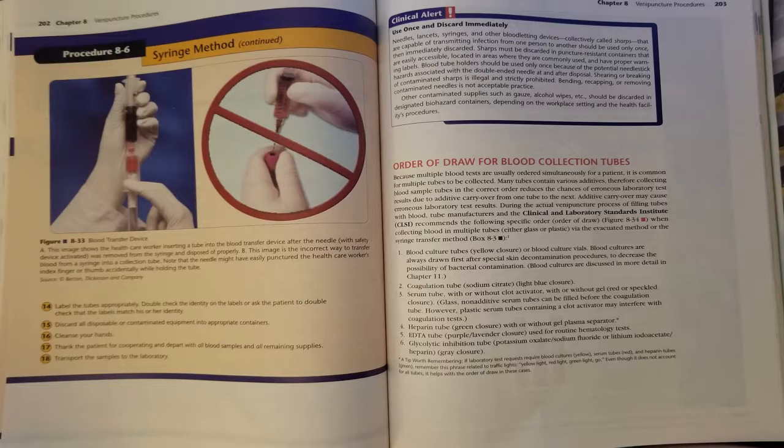Sharps must be discarded in puncture-resistant containers that are easily accessible, located in areas where they are commonly used, and have proper warning labels. Blood tube holders should be used only once because of the potential needle stick hazards associated with the double-ended needle at and after disposal. Shearing or breaking of contaminated sharps is illegal and strictly prohibited. Bending, recapping, or removing contaminated needles is not acceptable practice. Other contaminated supplies such as gauze and alcohol wipes should be discarded in designated biohazard containers depending on the workplace setting and the health facility's procedures.